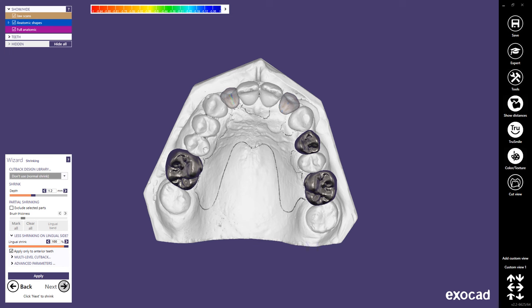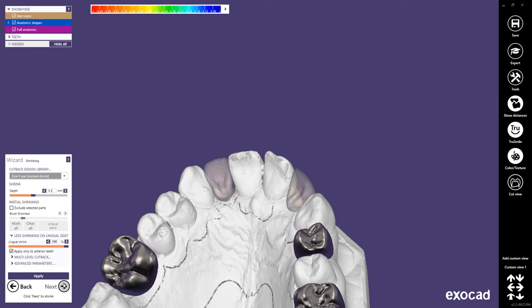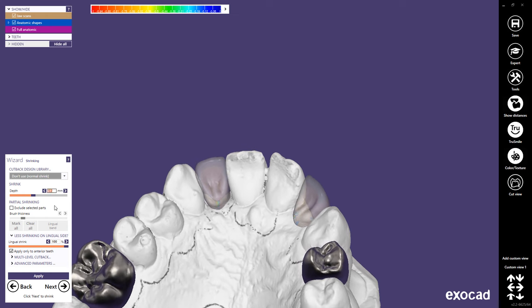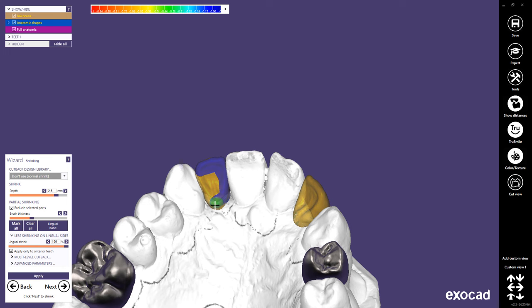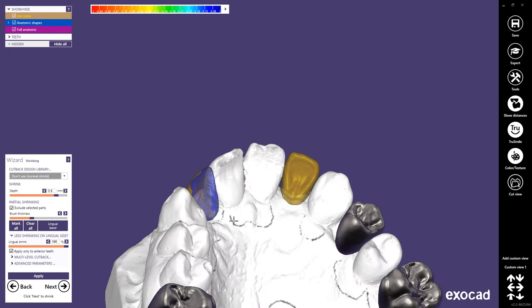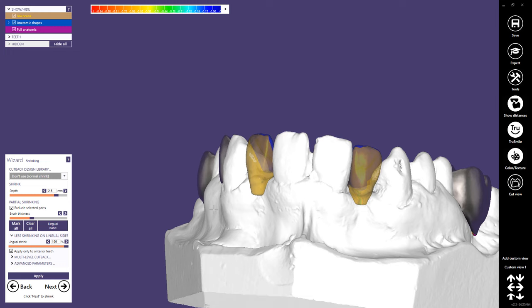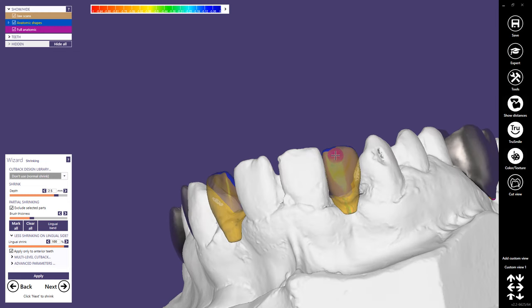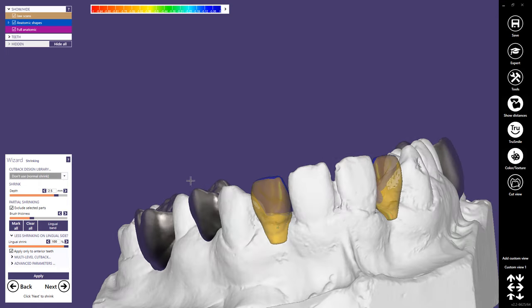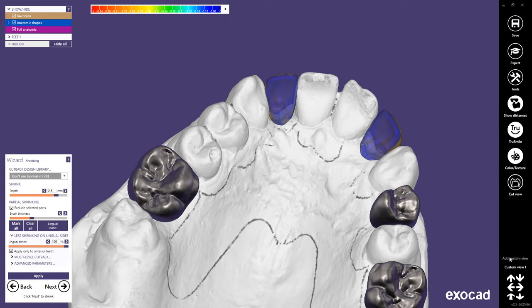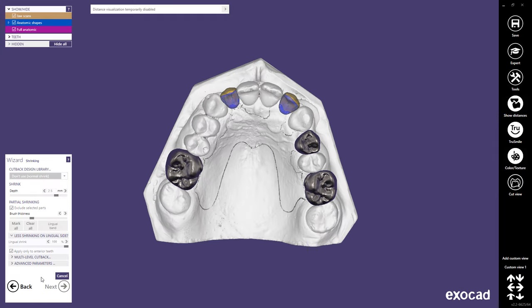In this step, I will show you how to use the shrinking step to create lingual backings. First, choose the desired shrinking depth, then check the box Exclude Selected Parts. The brush size can be adjusted by holding Shift and using the mouse wheel. Paint the areas of the tooth that you do not want to shrink. Notice the brush turns red when the hotkey Shift is held — this removes painted areas. Select Apply to shrink the pontic, then hit Next to proceed to the next step.